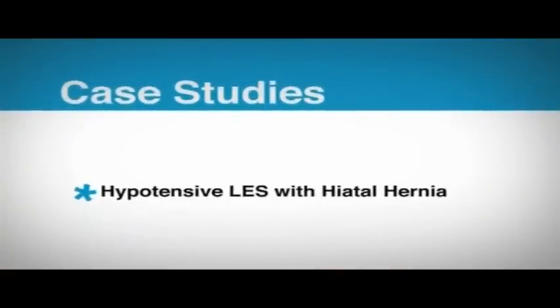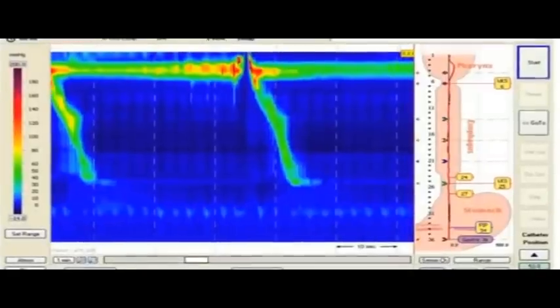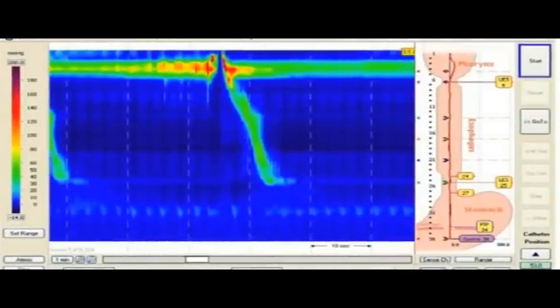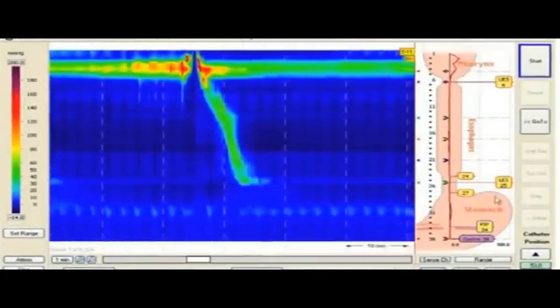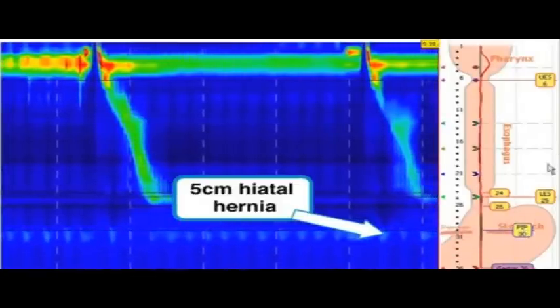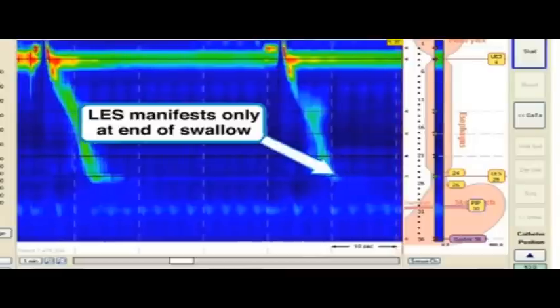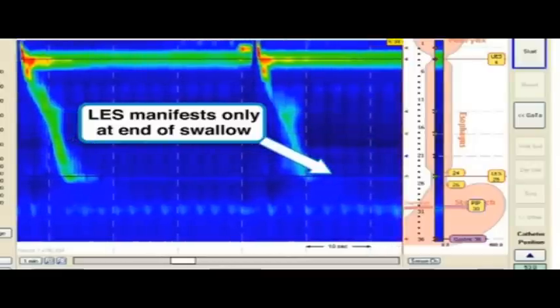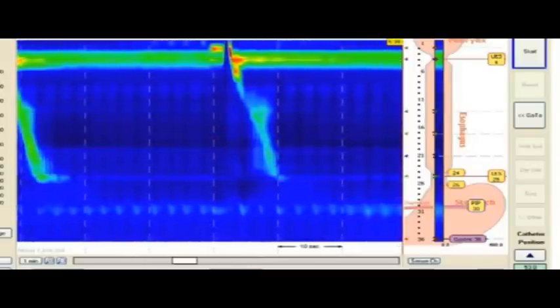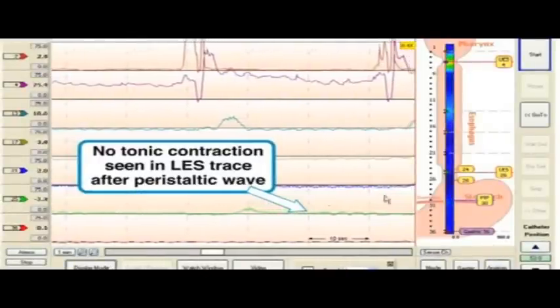Hypotensive LES with hiatal hernia. In this case, the pressure inversion point is clearly seen to be below the LES, and a 5-centimeter hernia is identified by simply moving the anatomical markers. The LES pressure manifests only briefly at the end of the swallow, with a near-complete loss of resting pressure at the sphincter. This loss of tonic contraction is also seen in the green LES line trace.